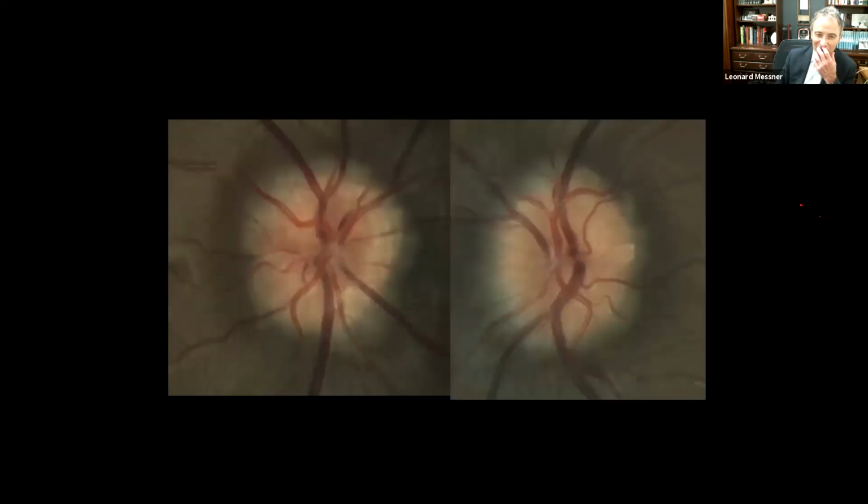So looking at her clinical photographs, what you can see are anomalous appearing optic nerves in both the right eye as well as the left eye, kind of an irregular appearance to the disc margin, both in the right eye as well as in the left eye. But if we look at the blood vessels, we see there's really no significant obscuration of vascular detail.